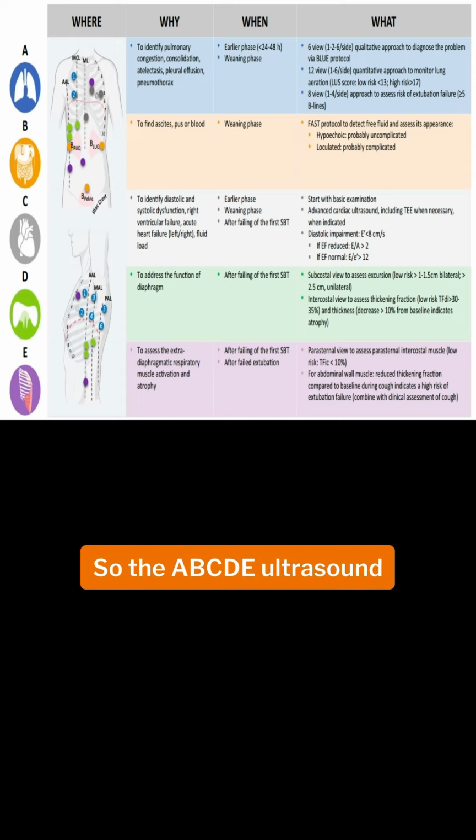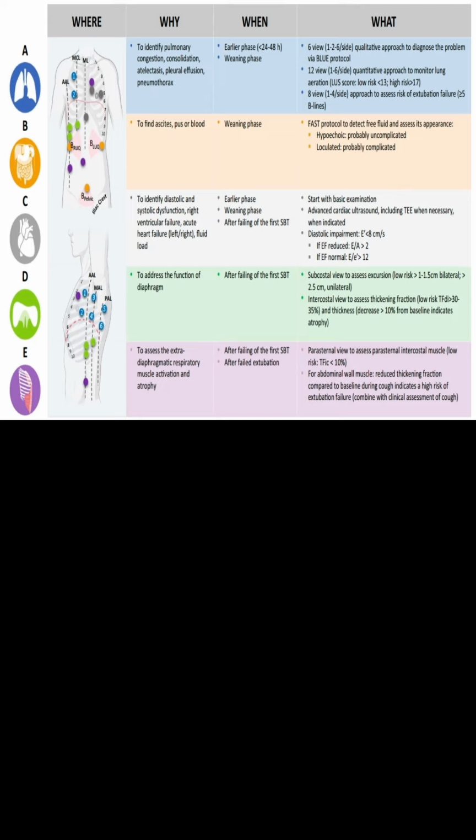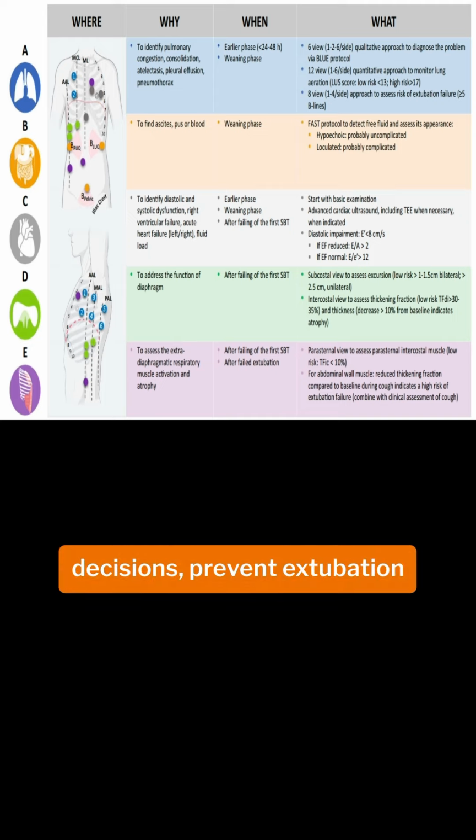So, the ABCDE ultrasound approach is a stepwise, system-wise scan to uncover the causes of weaning difficulty. It helps guide clinical decisions, prevent extubation failure, and personalize care for each patient in the ICU.